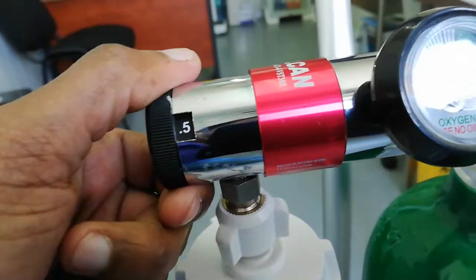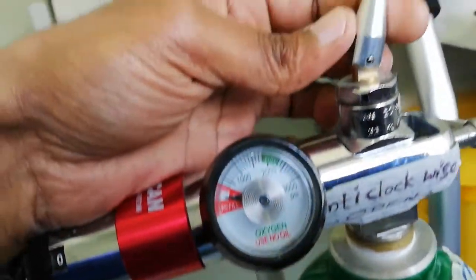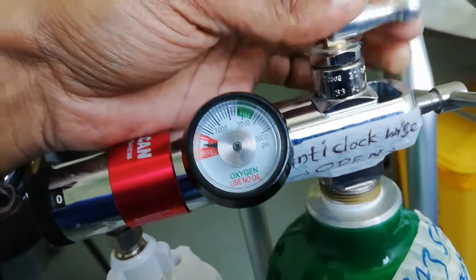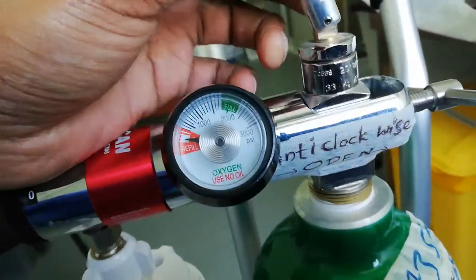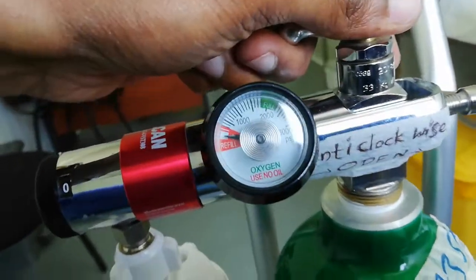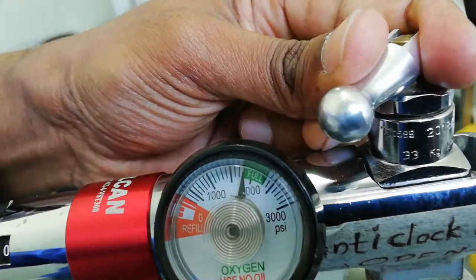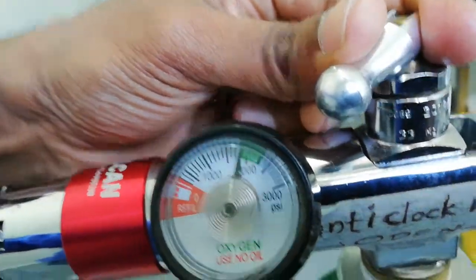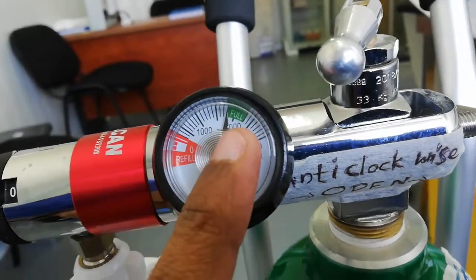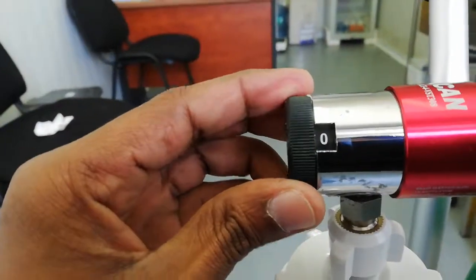Now this is the rotation — currently at zero. It will be opened in an anti-clockwise direction. When we open it anti-clockwise, we do not put it to full. Now this is set to one.